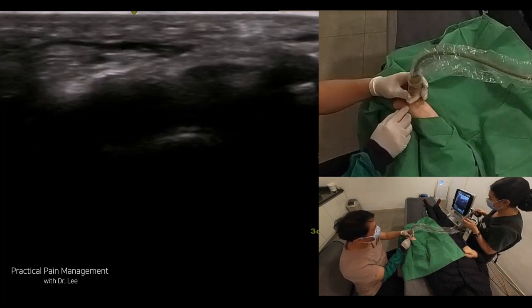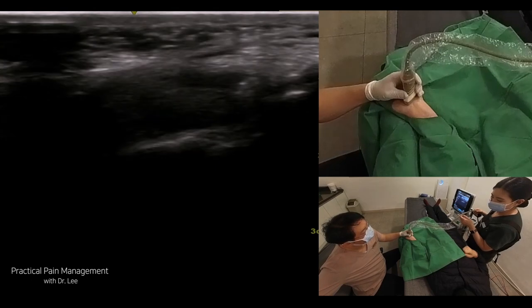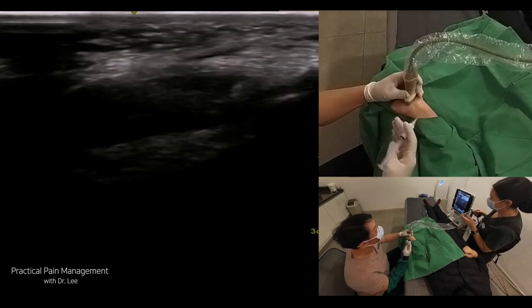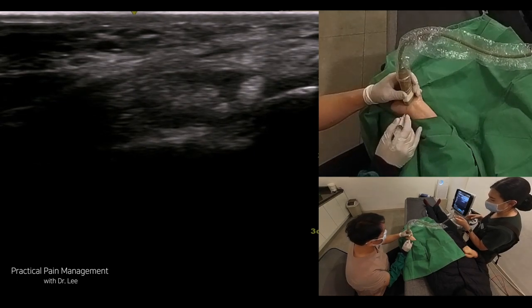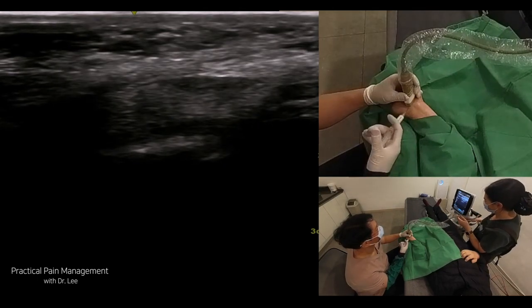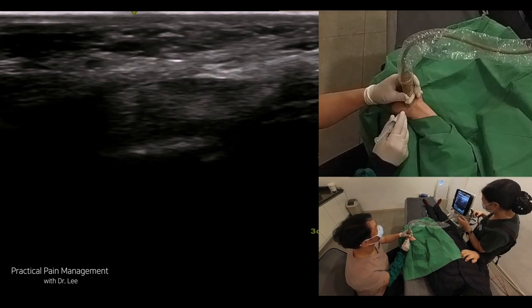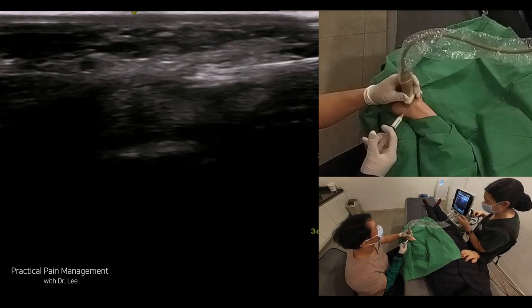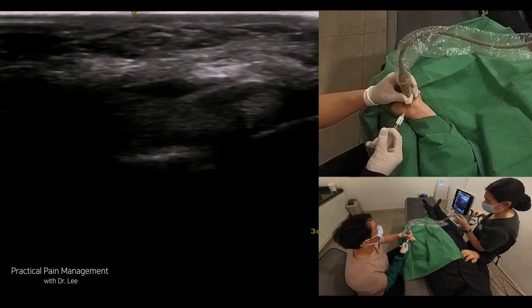Under ultrasound guidance, insert the needle in-plane, advancing it toward the carpal tunnel. I usually approach from the radial side, proximal to distal obliquely, watching the scaphoid bone and hook of the hamate. For the simple hydrodissection, I infiltrate a mixture of fluid between the transverse carpal ligament and median nerve. Most likely, I perform this procedure before the transverse carpal ligament release using a 17-gauge needle blade. Position the patient comfortably with the affected wrist resting on a table with soft support and palm facing upward. When the needle passes the transverse carpal ligament, I slowly inject a small amount of fluid into the space between the transverse carpal ligament and the median nerve.